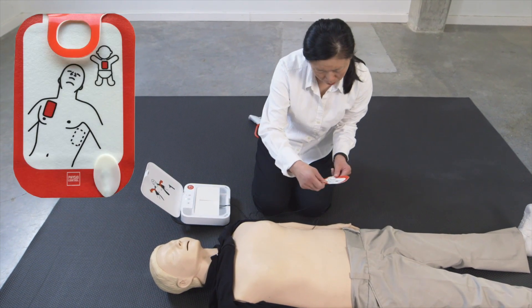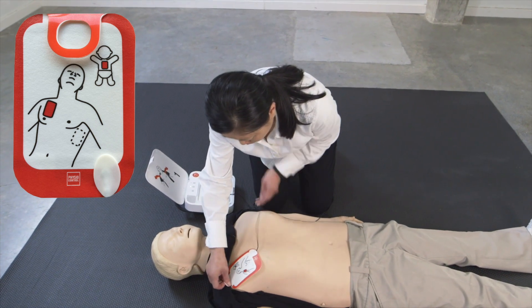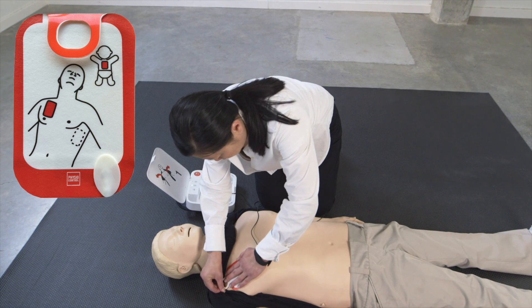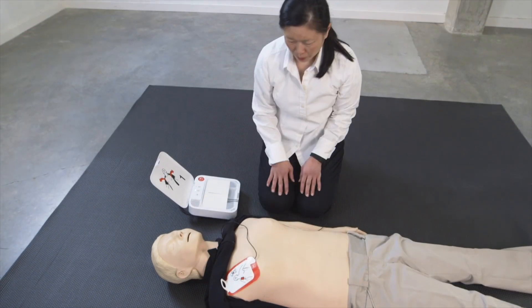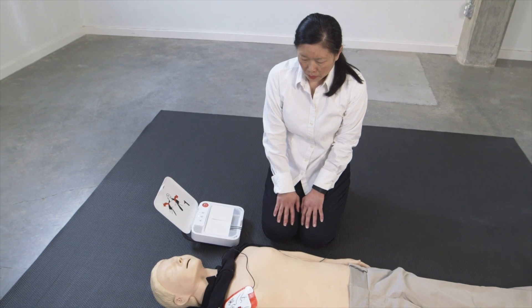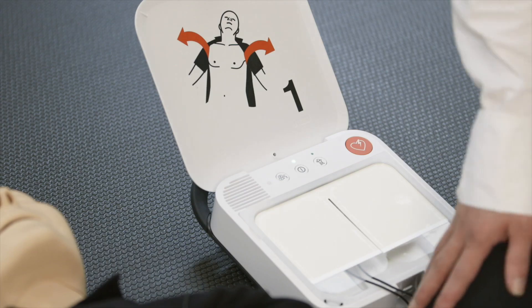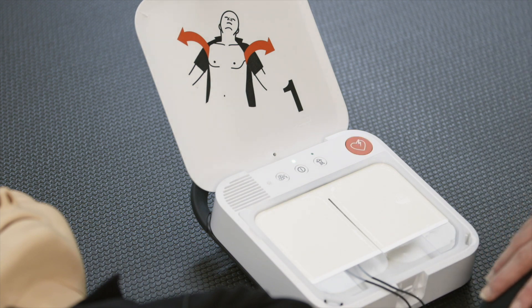Apply pads to bare skin exactly as shown in the pictures. Press pads — do not touch patient. Analyzing heart rhythm. Everyone clear.